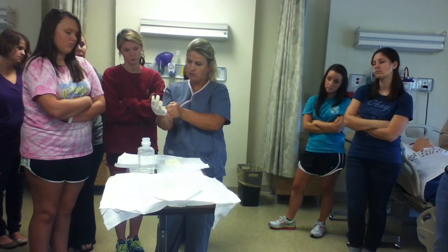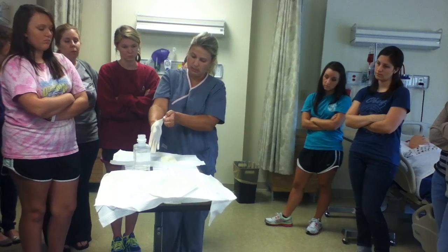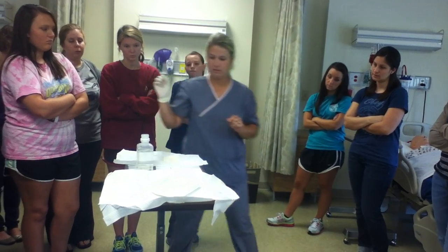Now, if you pick it up, also remember, these fingers will sometimes flop over, so my suggestion is to get used to kind of pointing it down like that till you get them on, and then you can put them up, okay? So I have my one sterile glove.